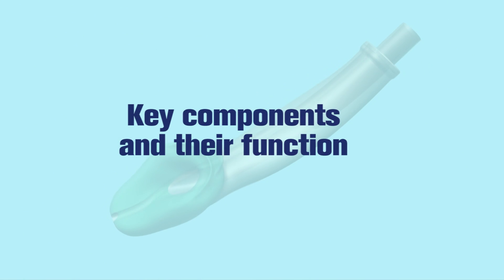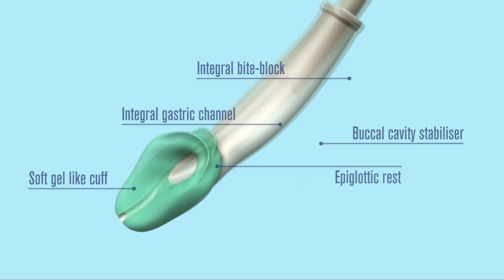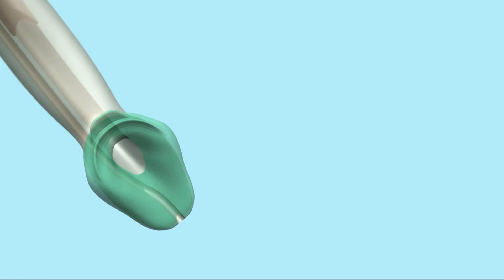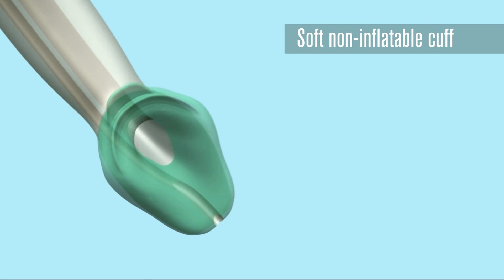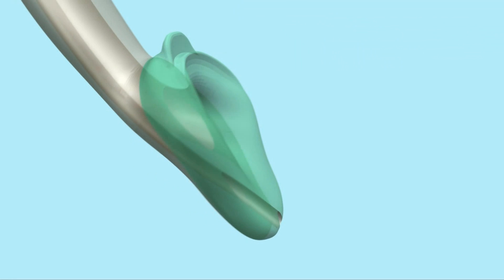Key components and their function. The soft, non-inflatable gel-like cuff matches the shape and softness of the laryngeal and perilaryngeal framework. It helps to provide easy and rapid insertion and reduces the potential for post-operative trauma.